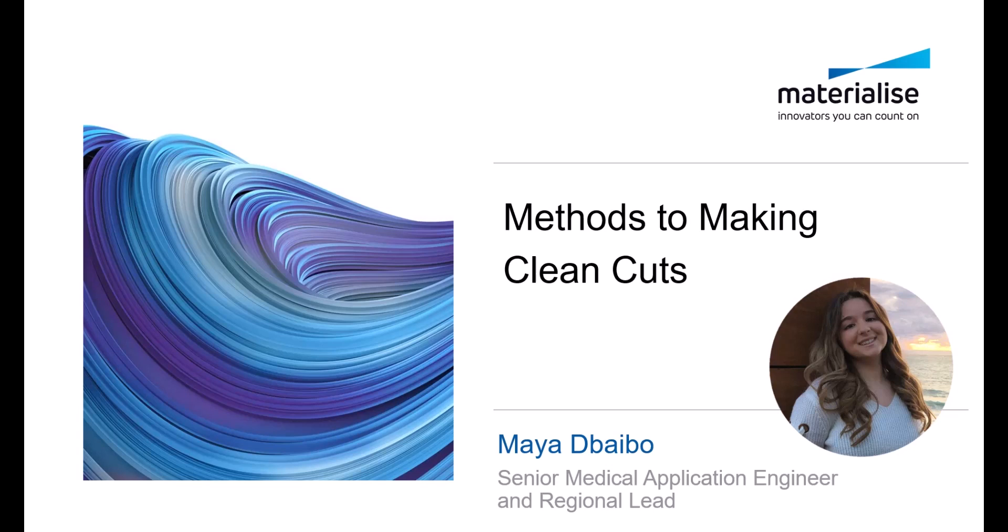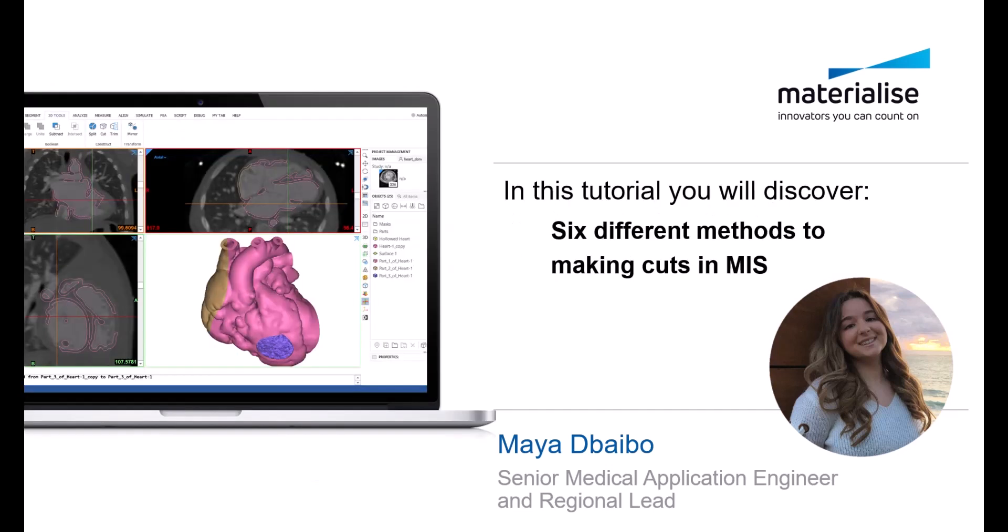Hi, I'm Maya DeBabel, a senior medical application engineer at Materialize. In this video, I will demonstrate how you can make perfect cuts in six different methods. No matter what type of model or what type of cut you need, Mimics should have you covered using the design module.